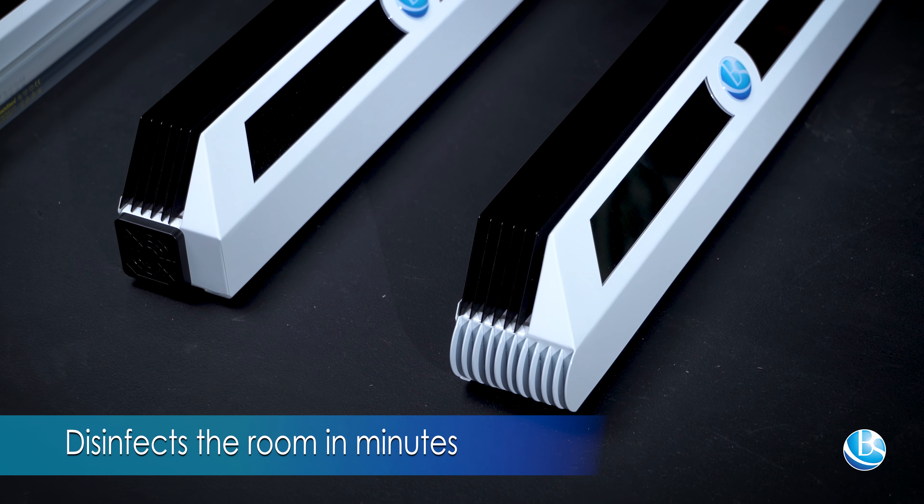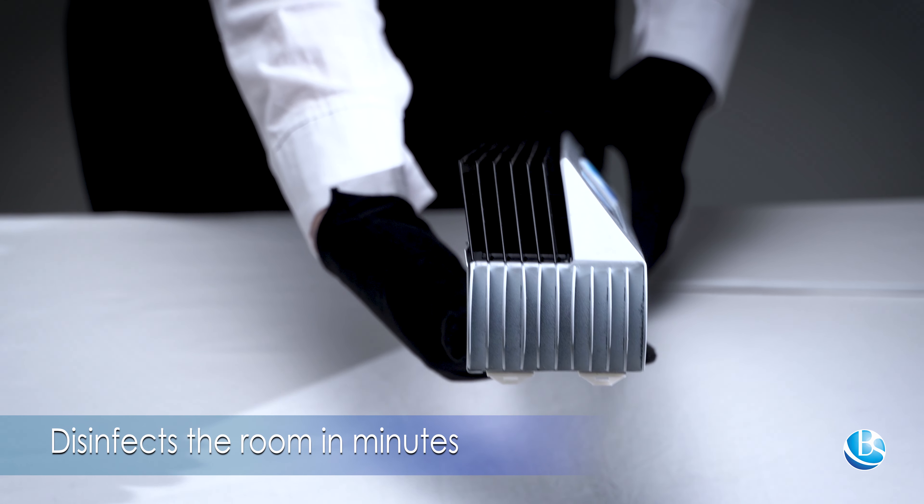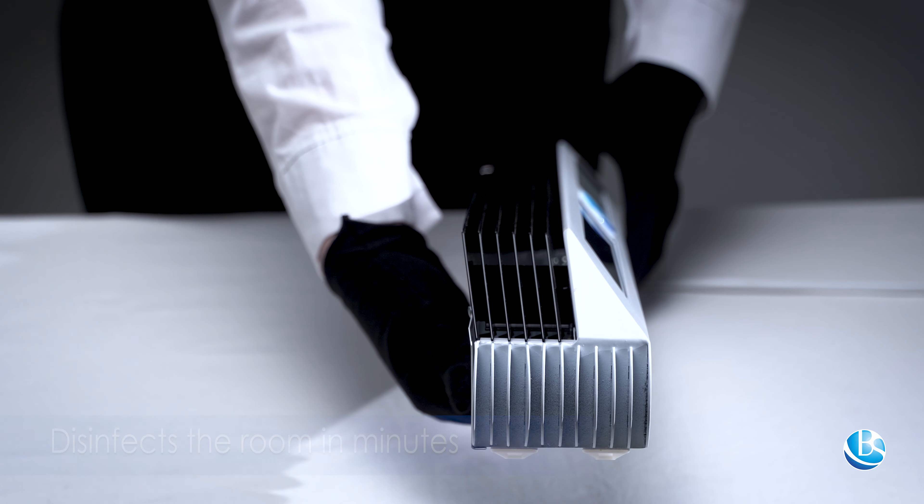The shielded irradiator disinfects the room in minutes, as it has a large radiation area. Operation is safe for people in the room.